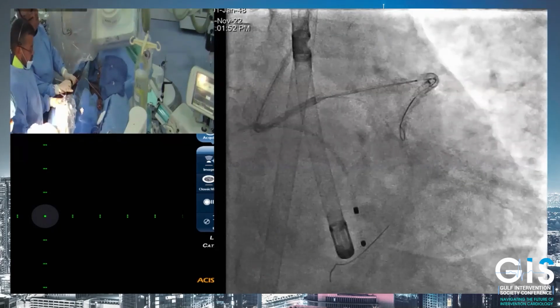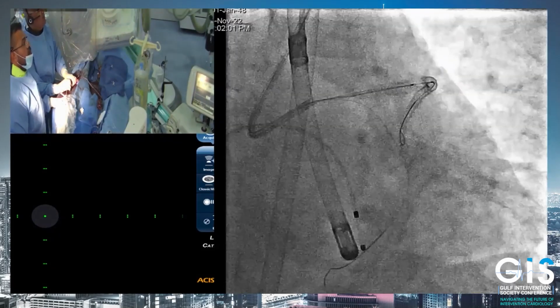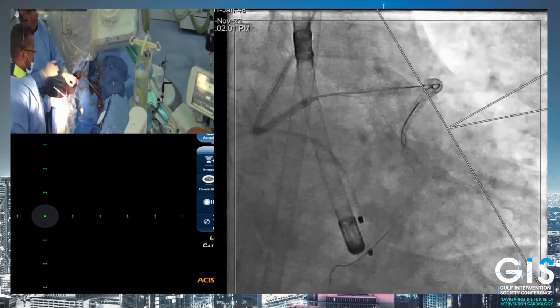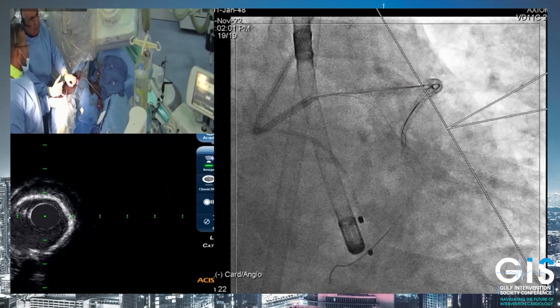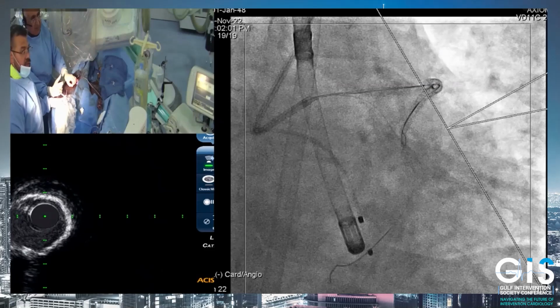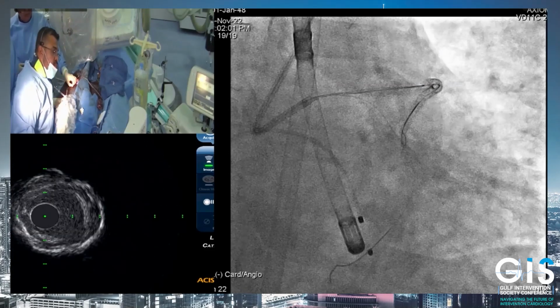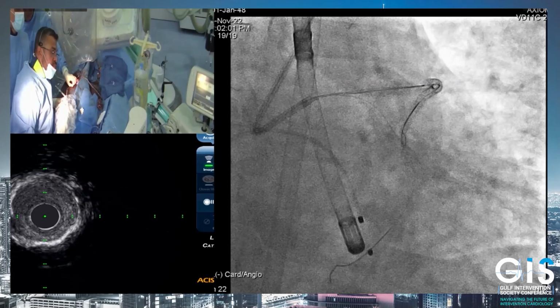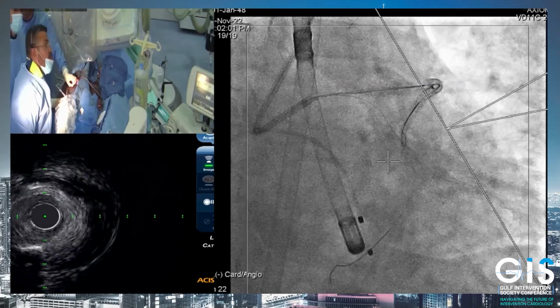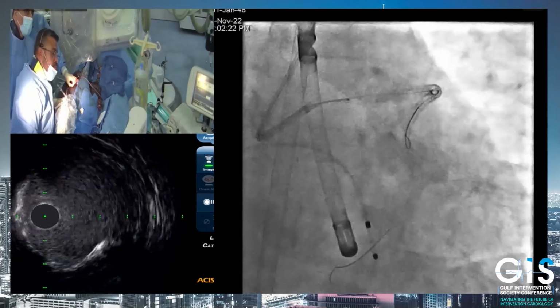The profile of the OCT is less than the profile of the IVUS catheter, but it is more flexible and less supported, if you might say. So whenever you need some support, IVUS can go. As you can see here, the IVUS catheter is pulled back from the LAD. You have a severe calcification. This is the wire of the circ.